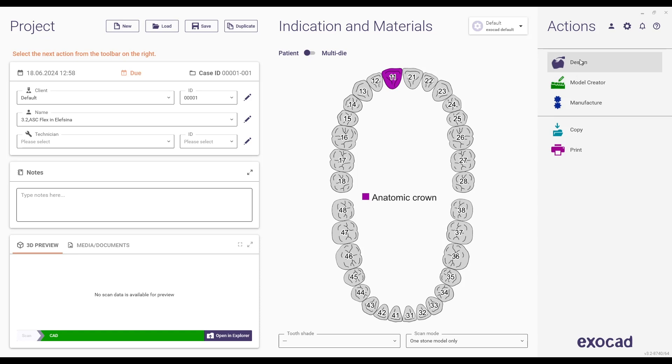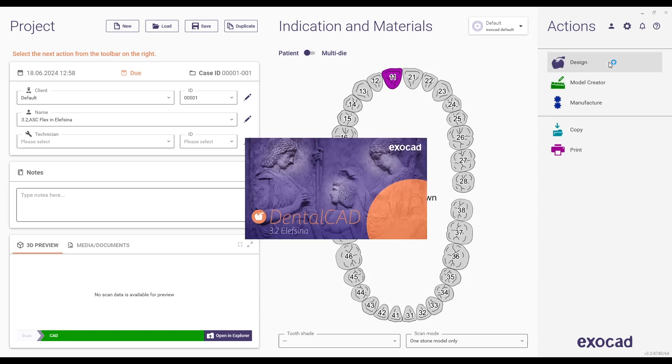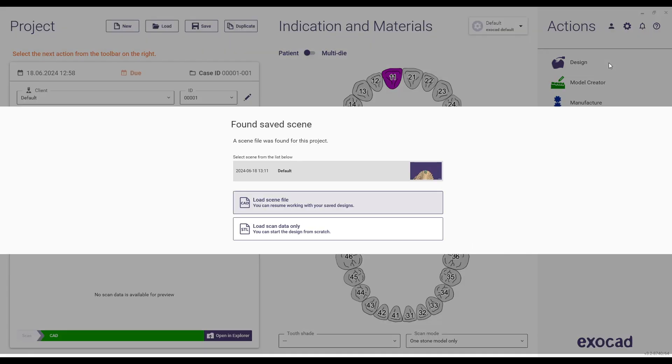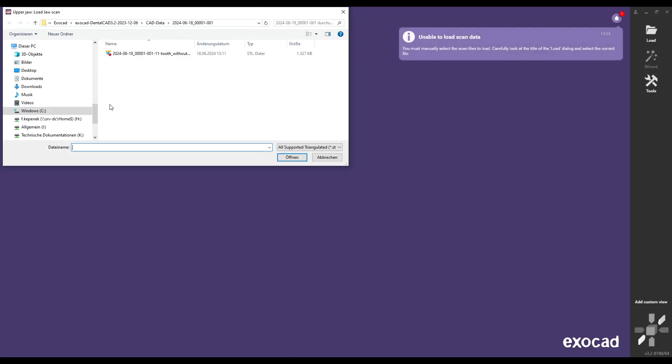Please note that the latest ASC Flex library from Medentica is compatible only with ExoCAD Dental CAD version 3.2 Elefcina and later. By following these instructions you will optimize your lab's digital processes and achieve high quality restorations.